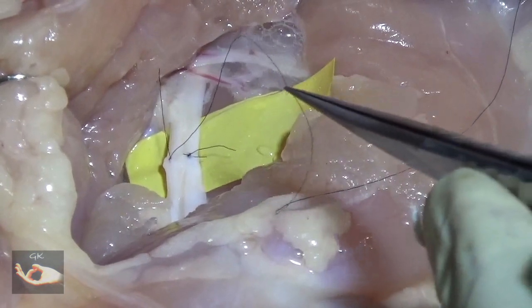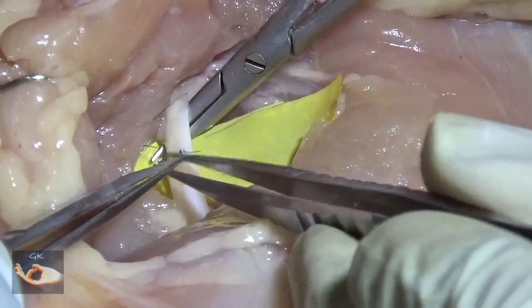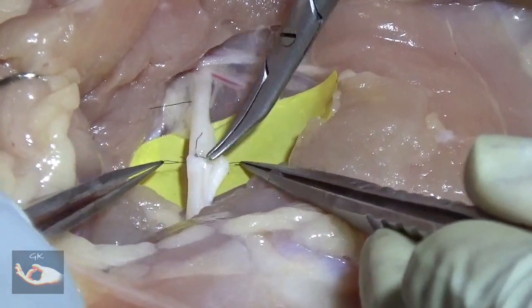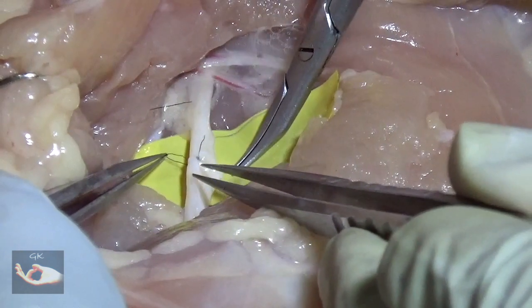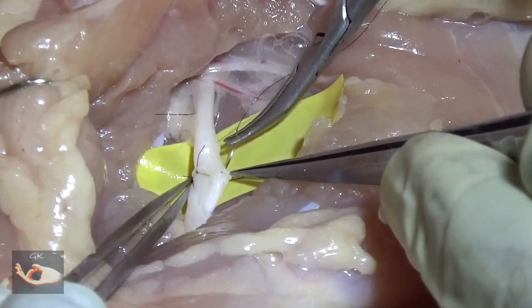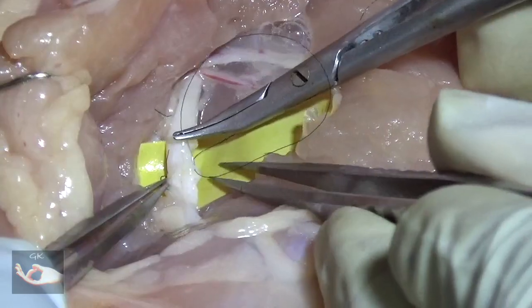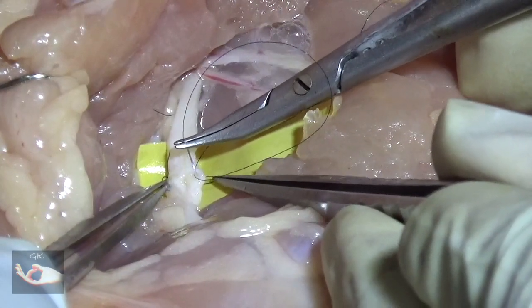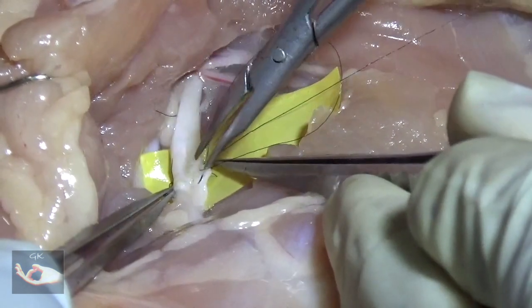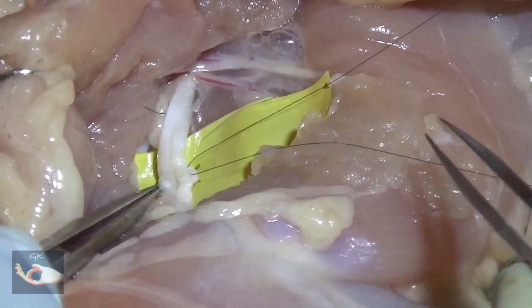Now that the anterior portion of the cut nerve has been repaired, we need to evert the nerve for suturing of the posterior side. For that, we grasp the lateral-most suture with the needle holder and pull it medially, holding it in such a way that the posterior portion of the cut nerve is now exposed for repair. The repair can now be done as described for the anterior side. You will note that there is more pouting of the fascicles on the posterior side — this is because after repairing the anterior epineurium, all the fascicles are now pouting on the posterior aspect. It would be ideal to do a posterior nerve repair first before going to the anterior side, as then it is much easier to deal with the protrusion of the fascicles.